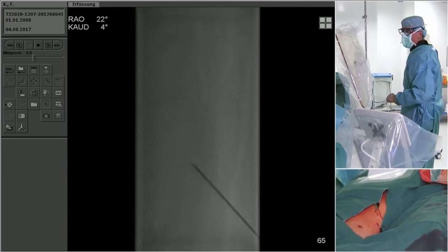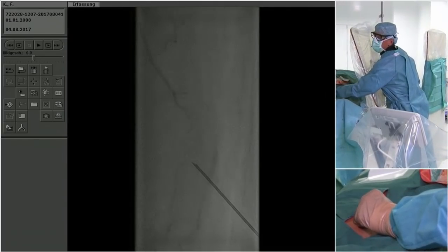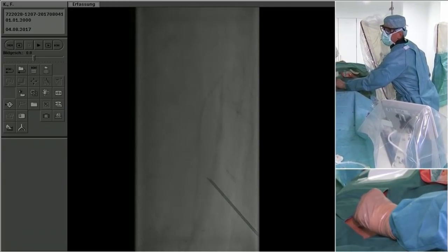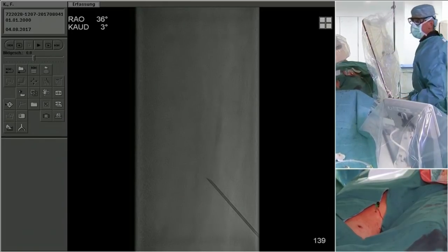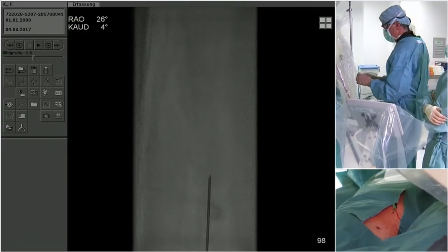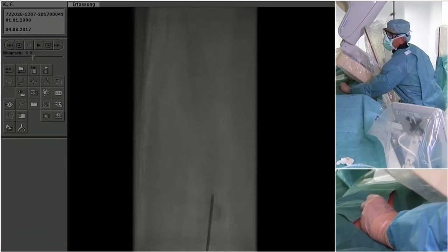While Andrej is doing this, I have a good question for the panel. There is also a distal segment, and Andrej gave some great explanation why he did not access the distal segment. Is there anyone on the panel who feels differently and actually might go a little bit lower? Sometimes if we know we're going to need retrograde access, we'll flip him over on the bed, use ultrasound, get popliteal access, put a longer sheath, and then put him back on the table supine. Usually we can then work from both access sites.